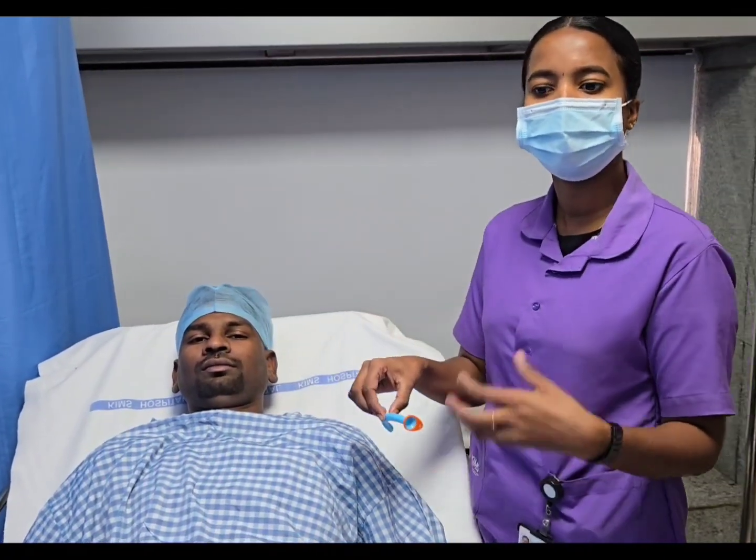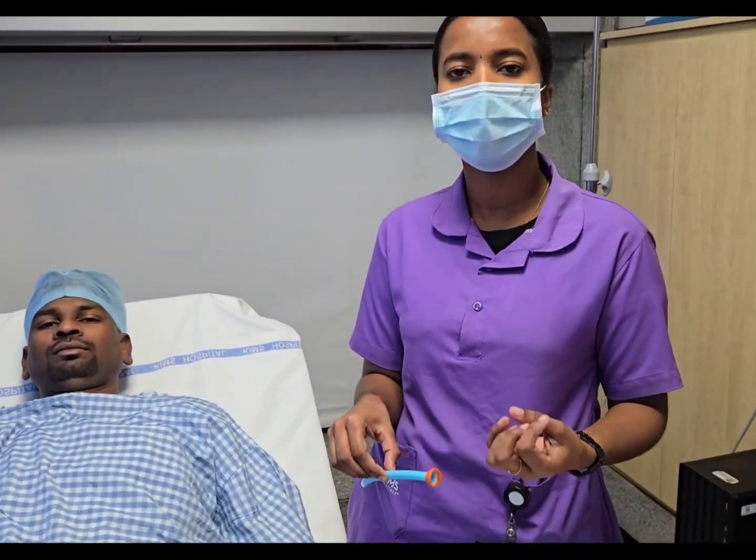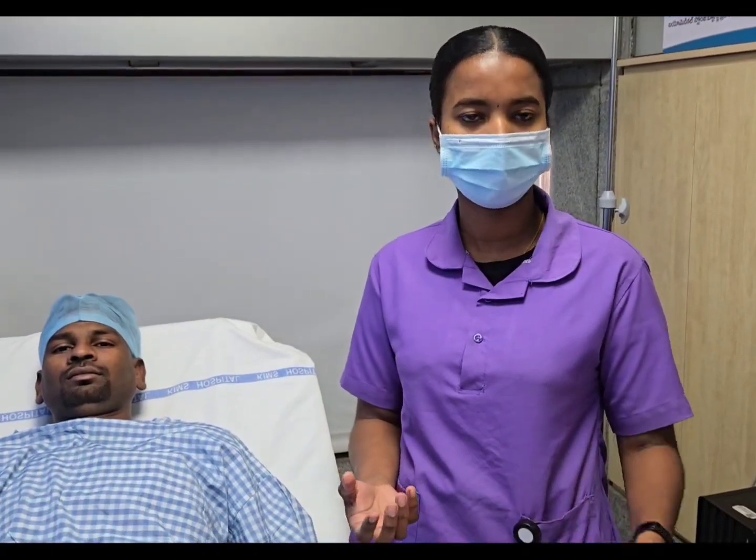Even when it is used, some complications may arise. The complications are trauma, bleeding, or airway obstruction.